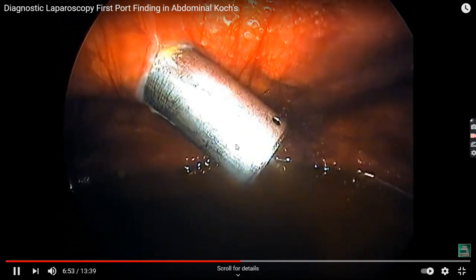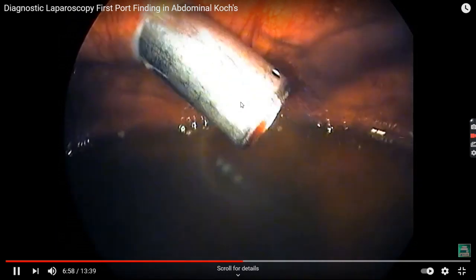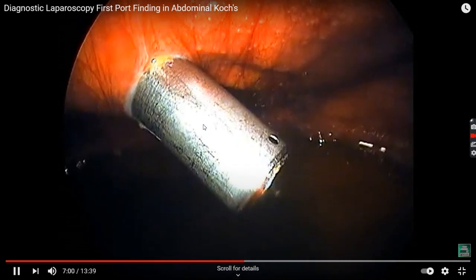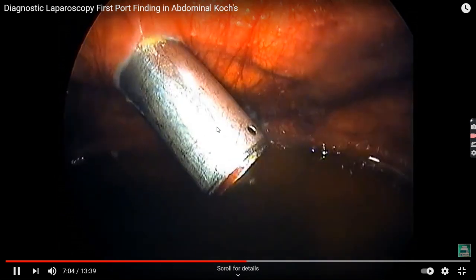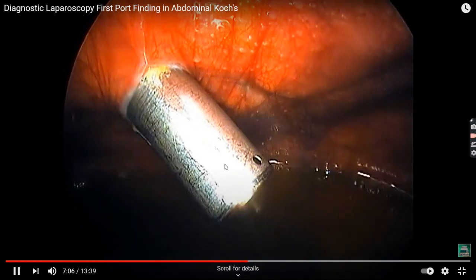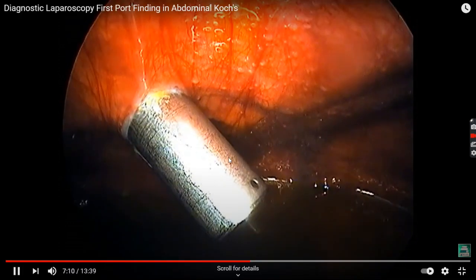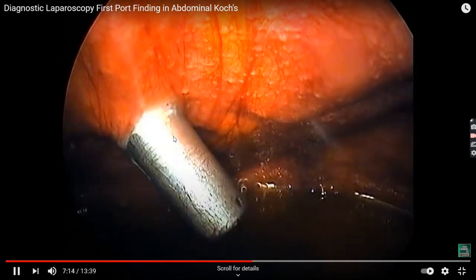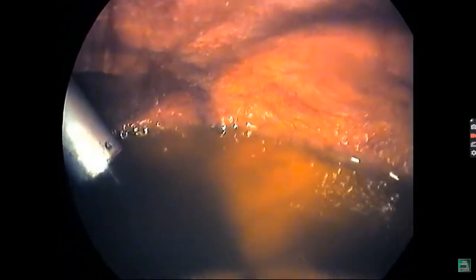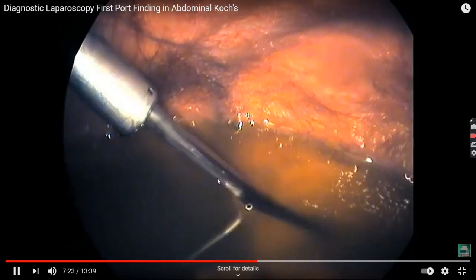although the beveled edge can be used, and I think better than this circular one, but this was available in the trolley, so we have used it, the circular one, this sheath of port. And after putting this 10 mm port, we'll insert a suction cannula inside after using a reducer. This is a 5 mm suction cannula.